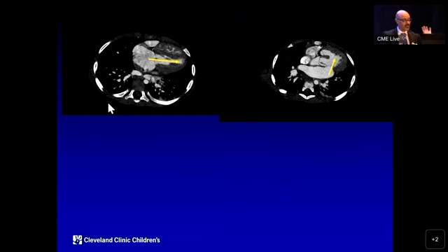So this was a case of abdominal atrial situs solitus, but you could see here that the right-sided atrium drained through the mitral valve to this inferiorly positioned left ventricle, and then the pulmonary veins drained through the tricuspid valve in this fashion to the more superior morphologic right ventricle, and that's why they are criss-cross AV connections. You could also see here that the two great vessels are coming off the right ventricle, so it's a double outlet right ventricle.